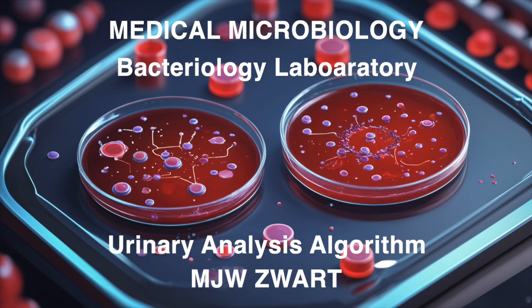This document dives deep into species-specific testing methods, going beyond the basics. For instance, there's a whole section on handling those more challenging organisms, like those producing ESBL and carbapenemase enzymes that make them resistant to important antibiotics. Well, back up a second. Could you explain those enzymes for our listeners who might not be as familiar with them?